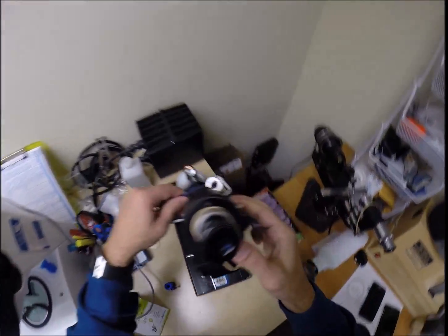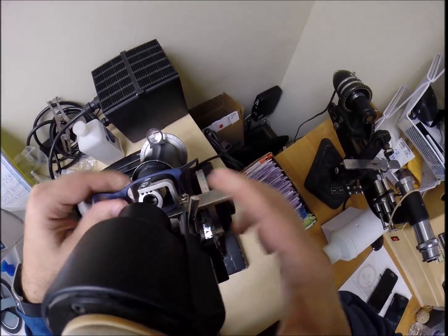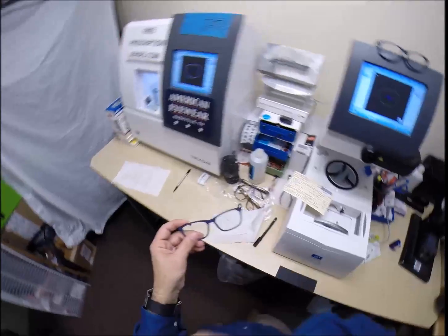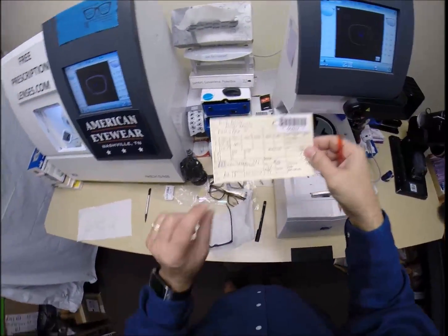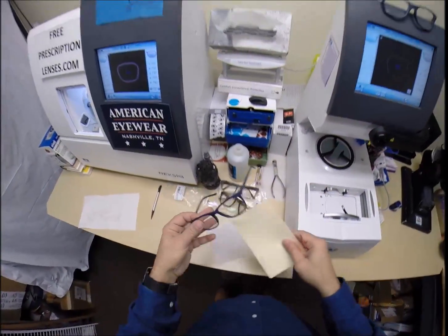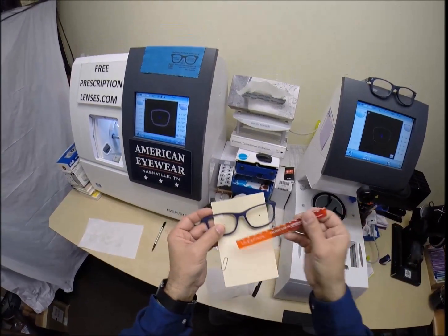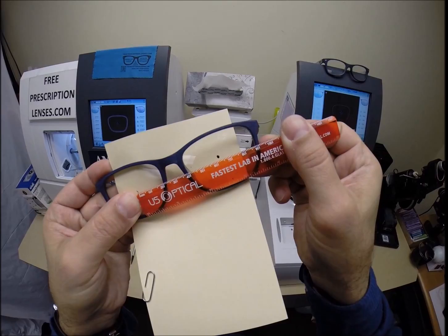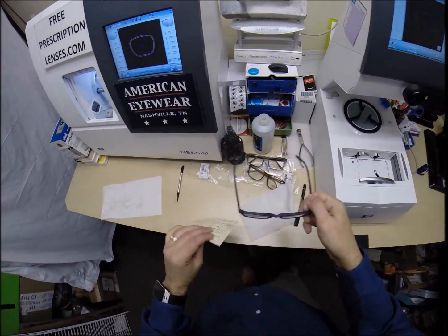So let's put that back in. Measure the pupillary distance. There, that's a good blob. Now your pupillary distance is 62. Let me flip the card around. Put that on there, place the PD stick against my thumb, and when we look at it on the left lens, we're getting 62 millimeters, so that is cut perfectly.